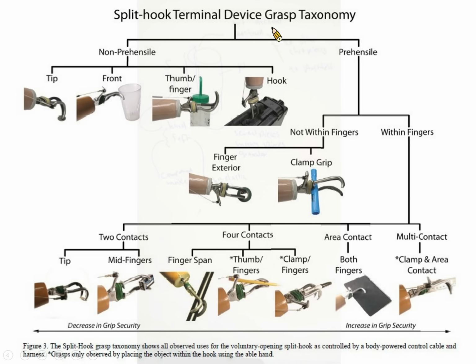Okay, there is a group of terminal devices. You can see one is the tip, like the thumb, the hook, or the double hook, we call the grip, without fingers. We call that a non-prehensile terminal device.